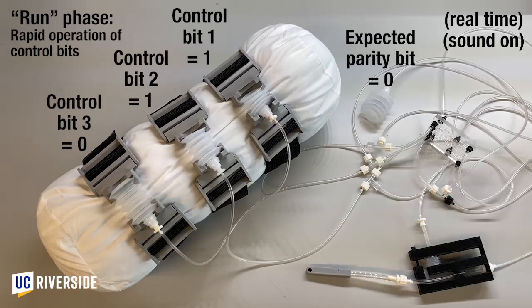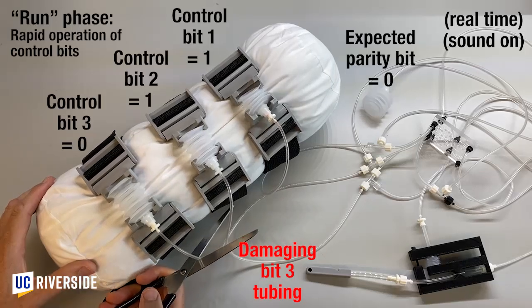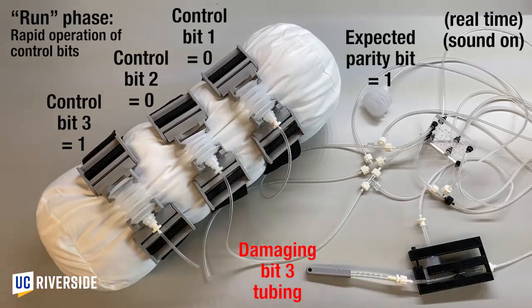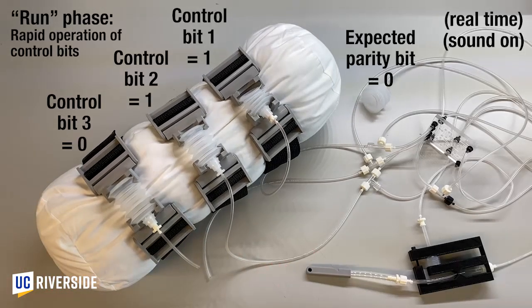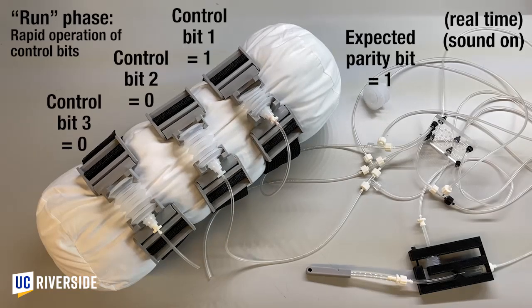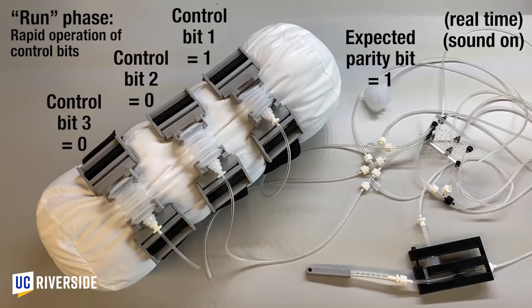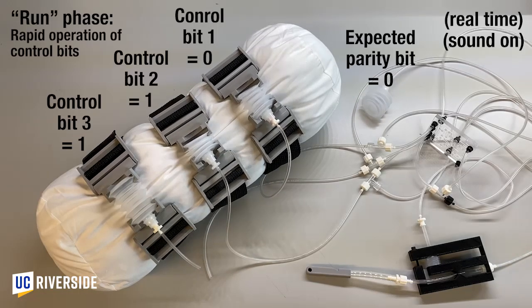The device then resumes rapid operation in the run phase. Now, we use a pair of scissors to cut the pneumatic tubing that supplies control bit 3. This simulates the kind of damage to the device that would render it inoperable and require the attention of the user. This error goes undetected while in the run phase, but it will be detected in the next check phase.